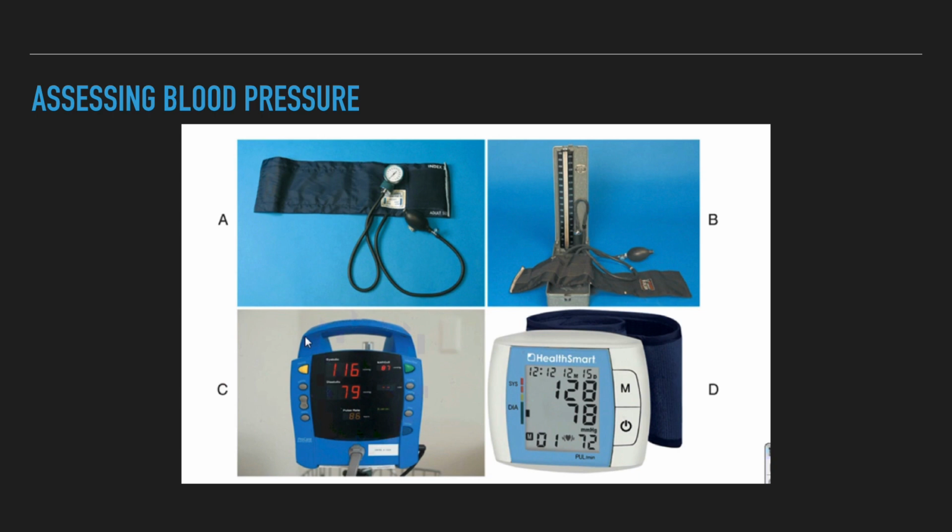Particulate matter or air bubbles in the glass tube distort readings. Enough mercury must be present in the reservoir to maintain the meniscus at 0 with the cuff deflated. The air vent at the top of the glass tube must be clean and allow free passage of air, or the mercury will be unable to rise and fall smoothly in the tube.